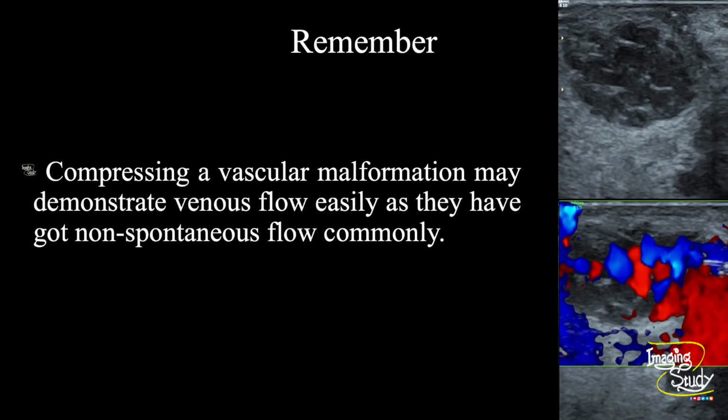Now the take-home message. Compressing a vascular malformation may demonstrate venous flow easily as they commonly have non-spontaneous flow.